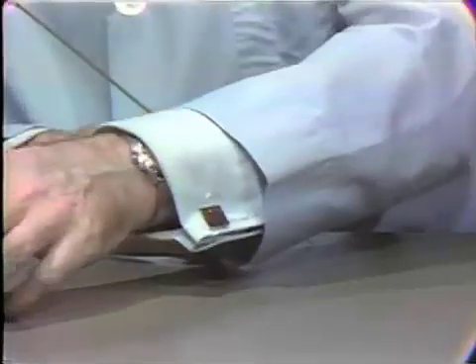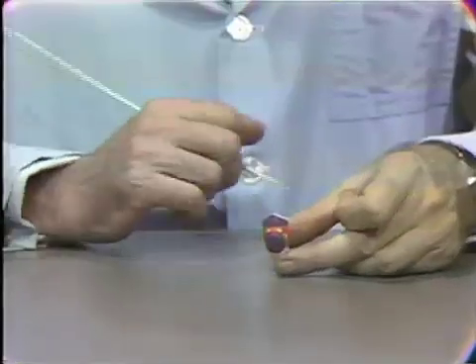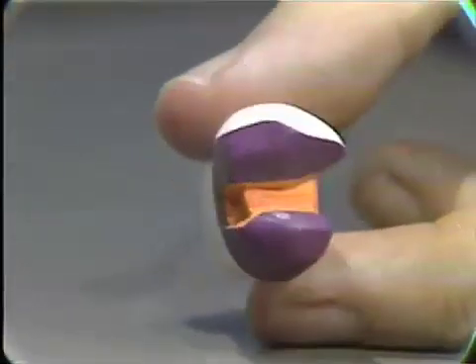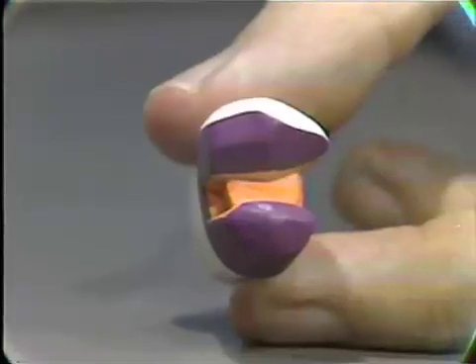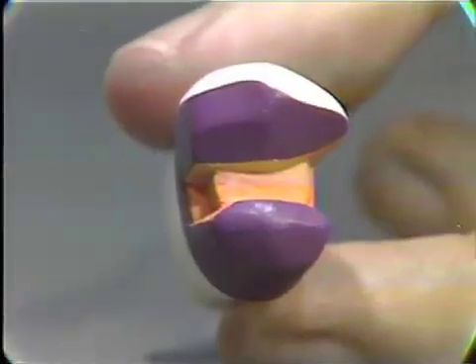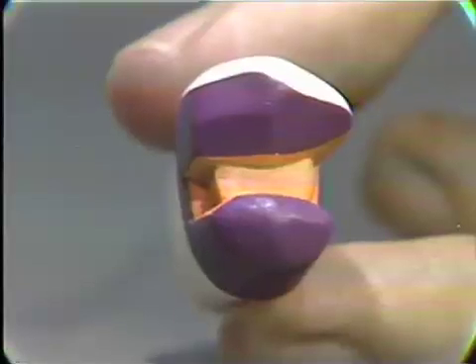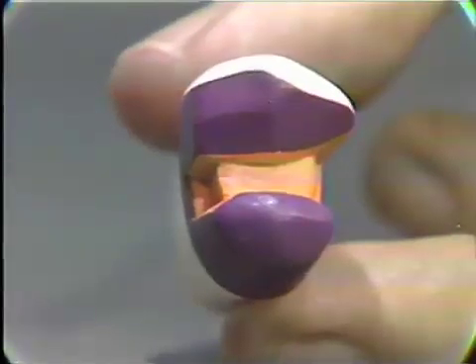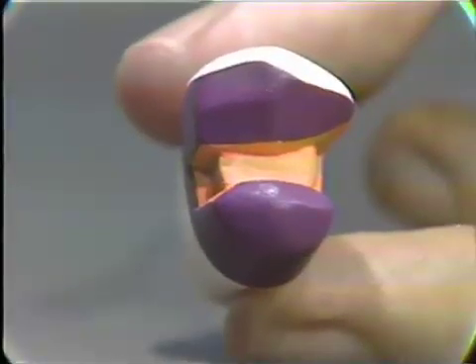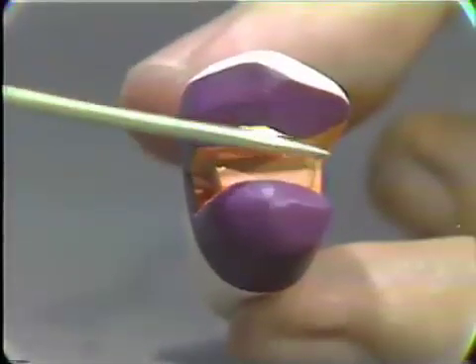A somewhat more extensive preparation than the one we were just looking at is one here using the box type of retention and an occlusal keyway running across the occlusal surface, as you see here. You can see that this creates a greater bulk of gold, and gives you a stronger and more rigid restoration. It is one that's typically used perhaps when there's already a previous restoration in the tooth, an MOD amalgam or an inlay maybe, in which this type of box and occlusal keyway has already been cut. This particular preparation shows a combination of both the slice on this surface here and of the box type of finish on the mesial here.